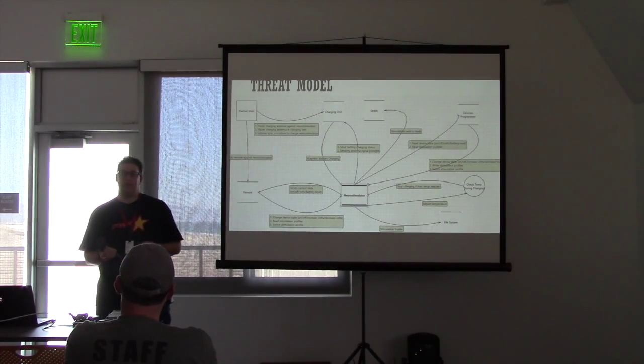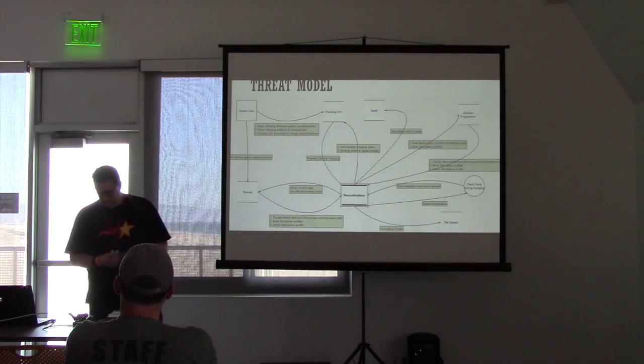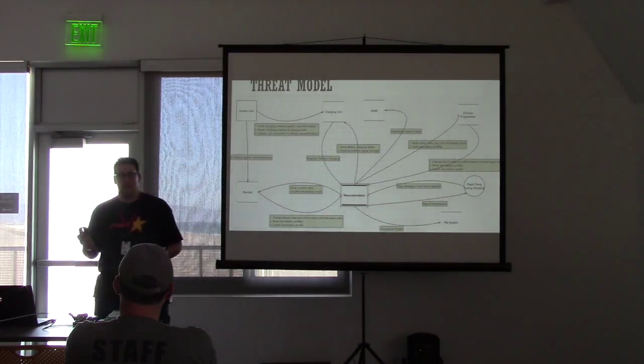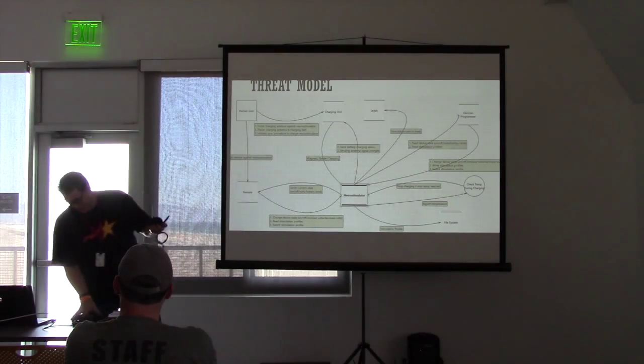Because the antenna is not in the implanted device. The antenna is in the remote itself. There's another option, which is this one that clips to your shirt, which is very fashionable, so that you can plug it into your remote and then clip it on your clothes and sort of pull your shirt through so that you can charge or change the signal without having to hold your hand behind your back.